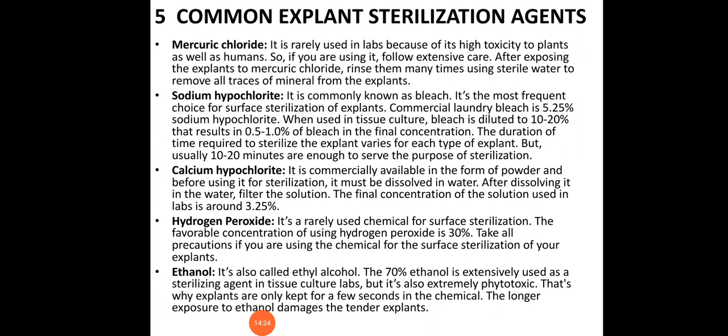Commercial laundry bleach is 5.25% sodium hypochlorite. When used in tissue culture, bleach is diluted 10 to 20%, which results in 0.5 to 1%. So here the duration of time matters, and some materials can be avoided.